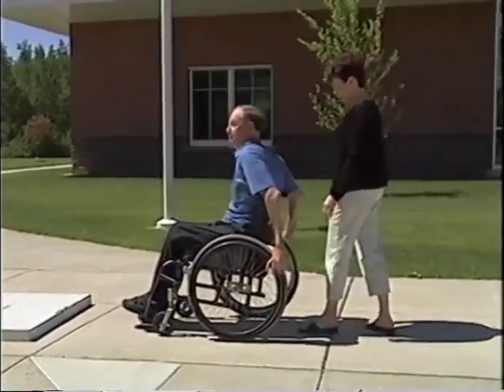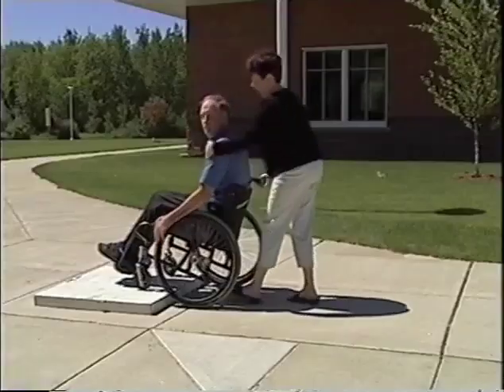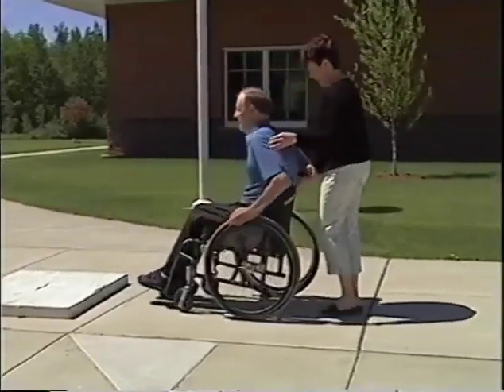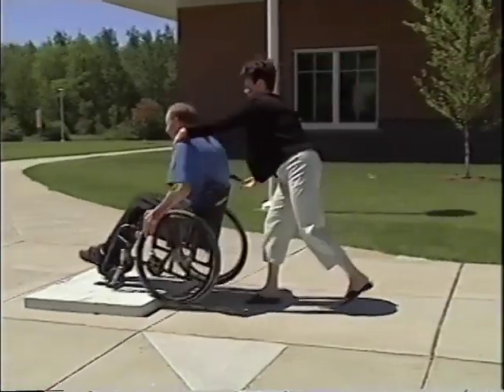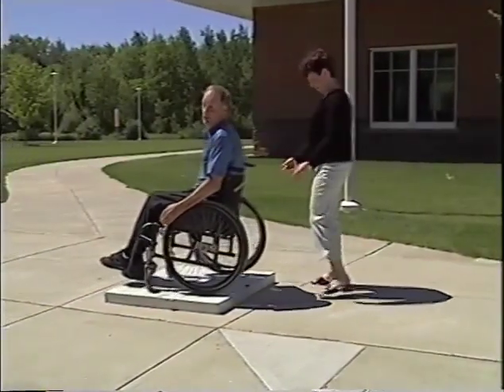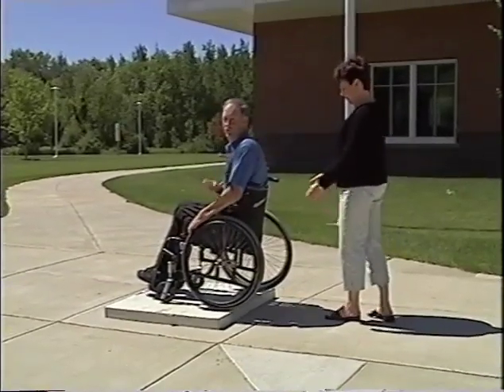You ready? Yep. Nope, it's fine. So you can see the feet off there. All right, and there I just made it. So when you see the front end bounce up again, you know you don't have just enough wheelie.